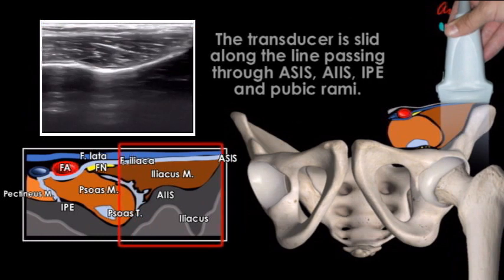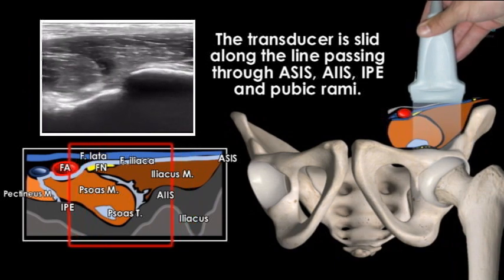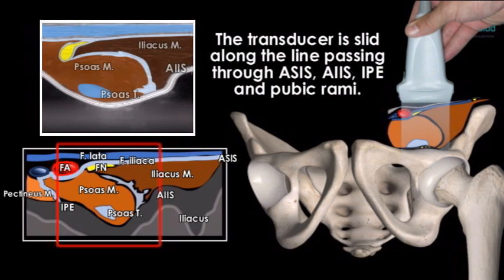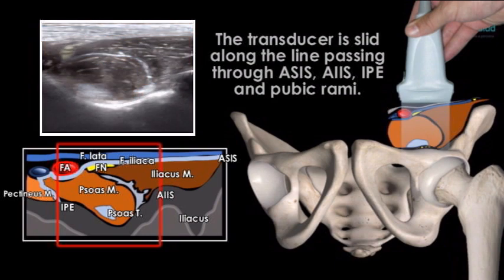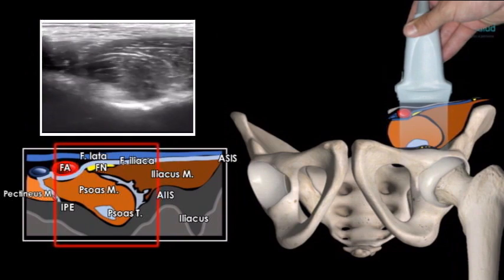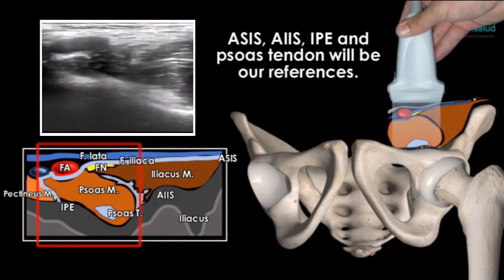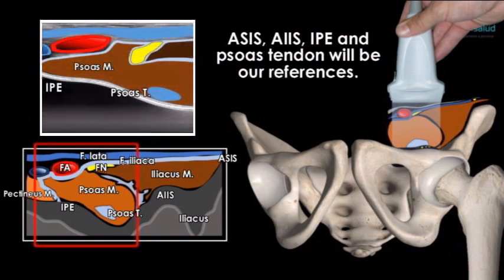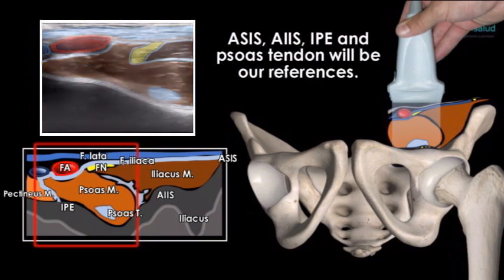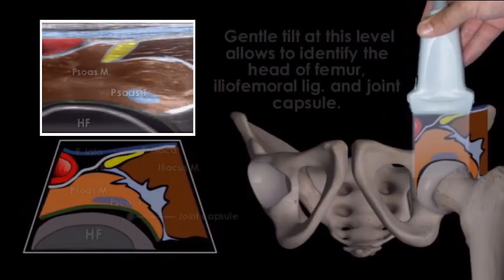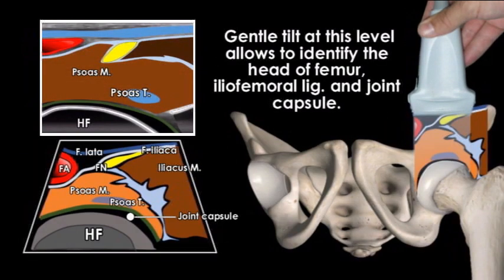By sliding the transducer over the described plane, the AIIS will be identified as a hyperechoic prominence with the iliac muscle over it. The psoas muscle and psoas tendon will be seen lying between the ASIS and the iliopubic eminence. With a distal slide or gentle tilt, we identify the head of the femur and the joint capsule of the hip.